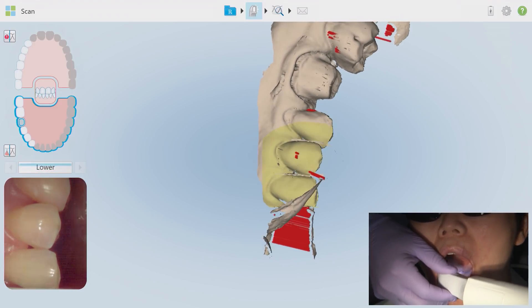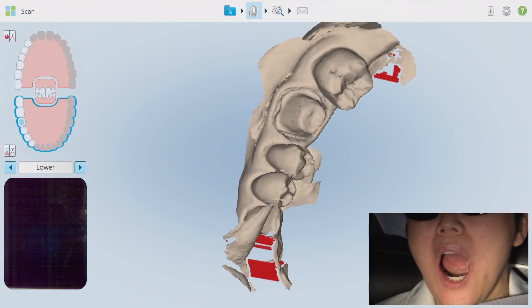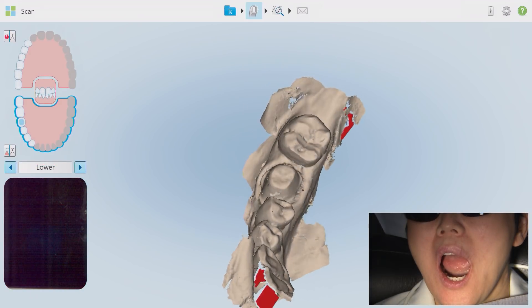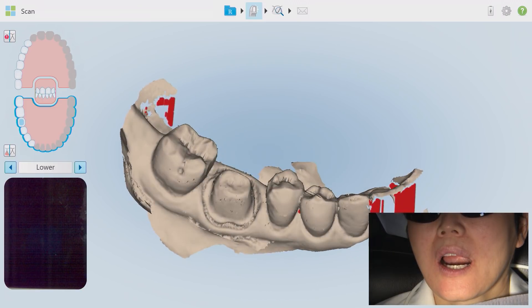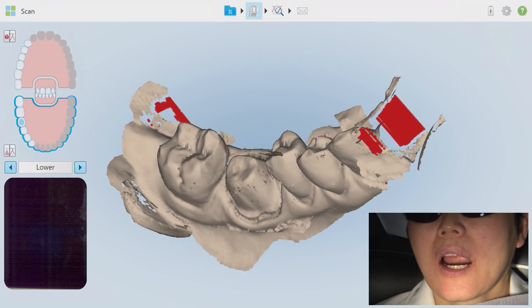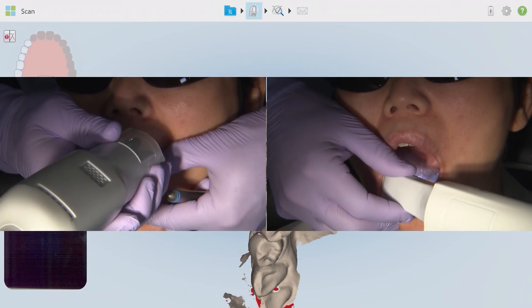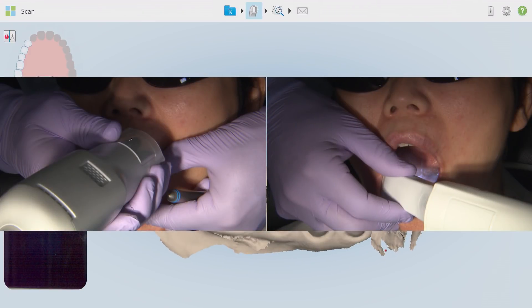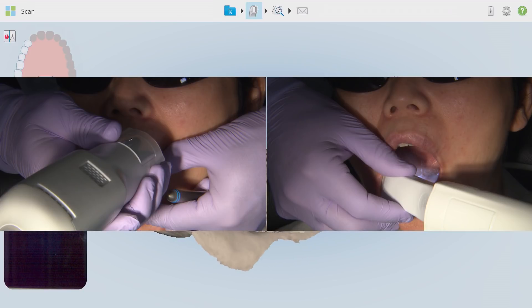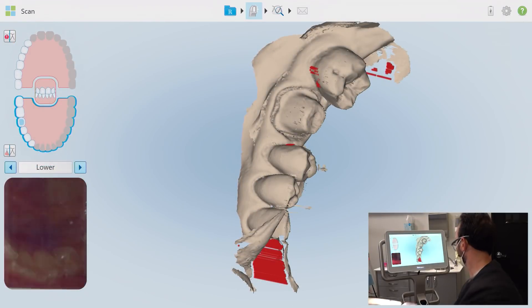Take note of my hand position change. This patient holds her lip a bit more tightly to her teeth than I'd like, so I switch my hand just to hold the wand tip steadier throughout the anterior section. After a good amount of experience with the iTero Element you'll develop your own comfortable workarounds for more difficult areas. Perfect hand position, in my opinion, is defined as your most solid ergonomic grasp in the moment that acquires the highest quality data in the least amount of time with no patient discomfort.